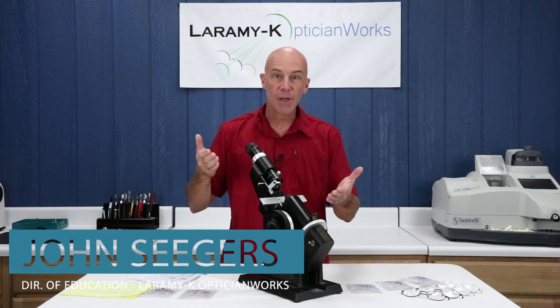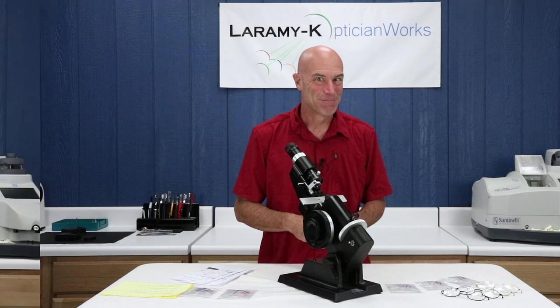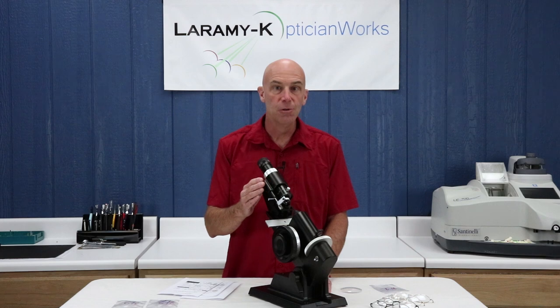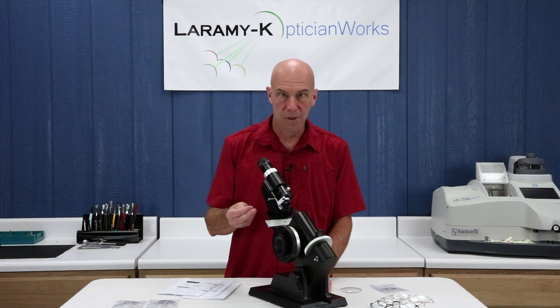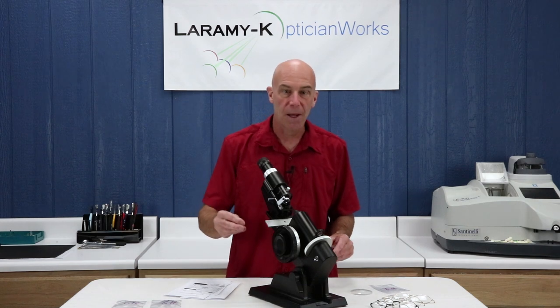Welcome to the first in our series on how to use the lens meter. Make sure you watch this all the way through to the end for a special TV offer. The Marco LM101 is the most common lens meter in use in our industry today, so it is vitally important that you know how to use it. There are going to be things I'm saying here that you'll have no idea what I'm talking about — none. Don't worry about that.